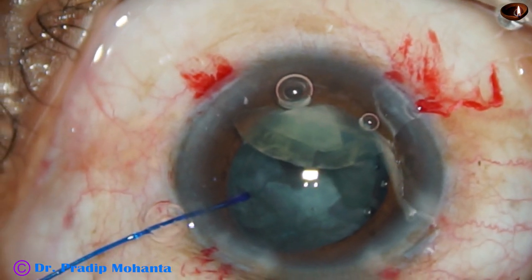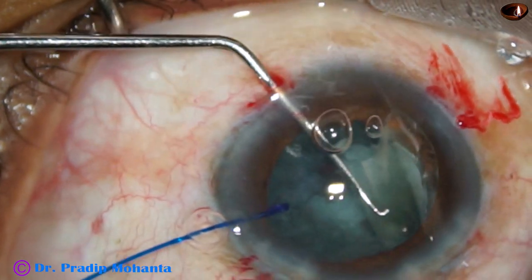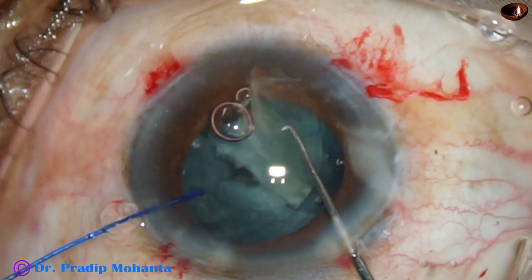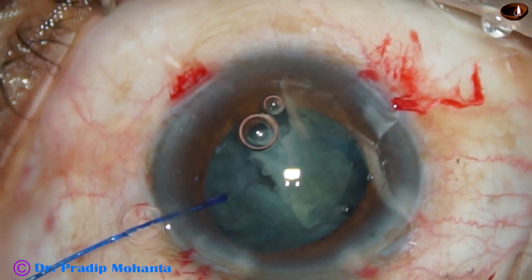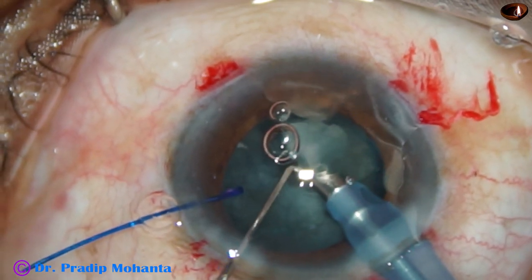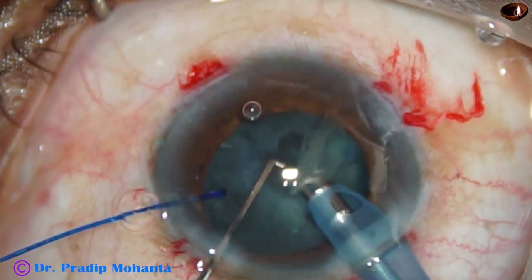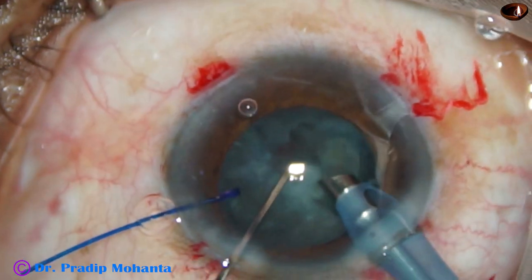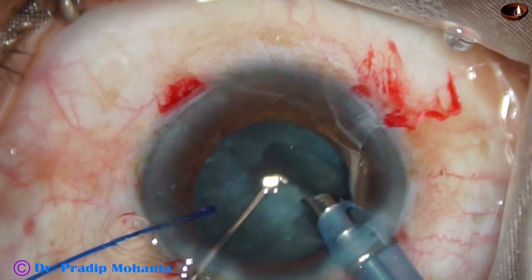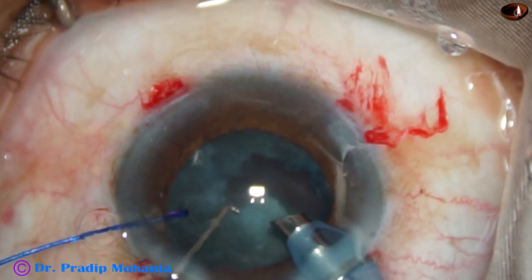I could make out that only the lower fragment could be emulsified, and the other fragment is not coming. So I come out, inject viscoelastic, and with the help of a Szynski hook, push it down to the iris plane. Then again go with the phaco needle. Unless we take care of the corneal endothelium and the posterior capsule, unless we are patient and cautious and proactive in such cases, disaster can happen at any moment.